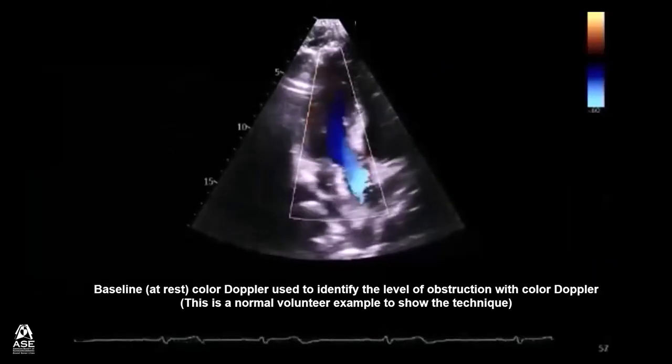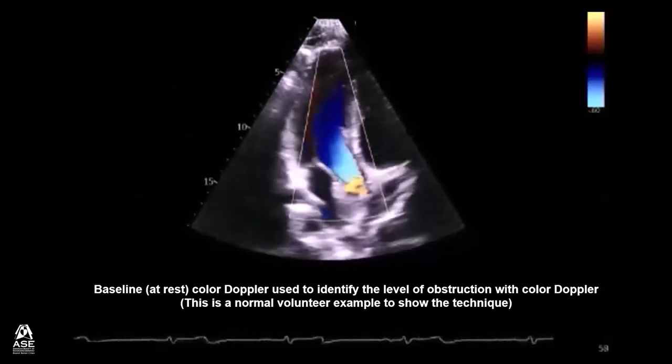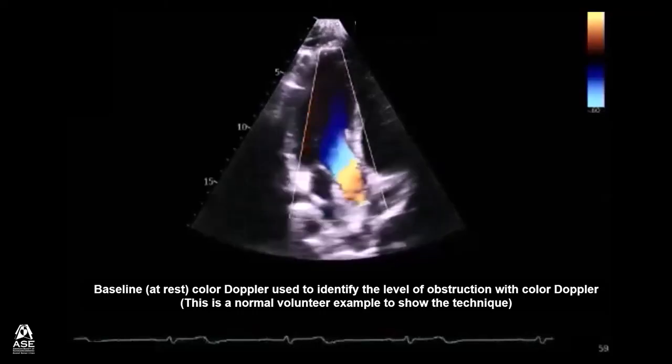This video demonstrates, at rest, the color Doppler used to identify the level of obstruction. This is a normal volunteer with an example just to show the technique.